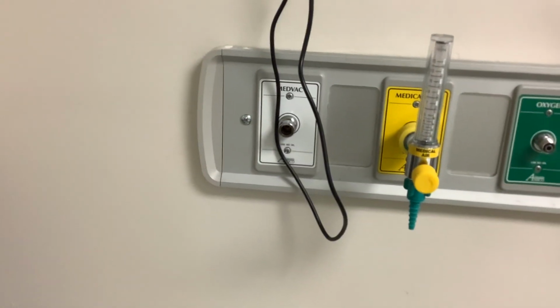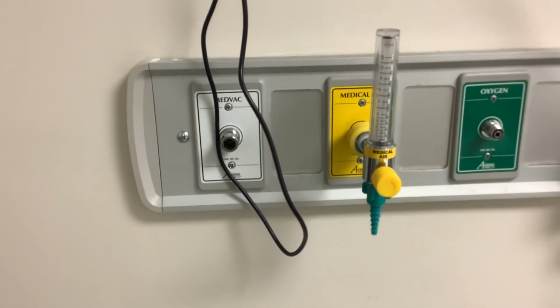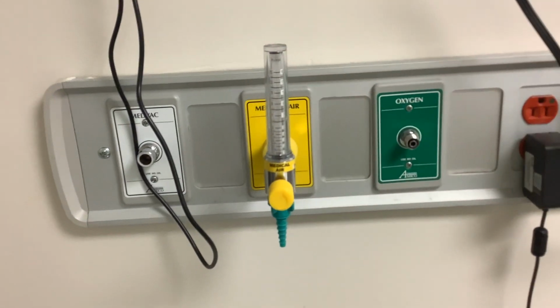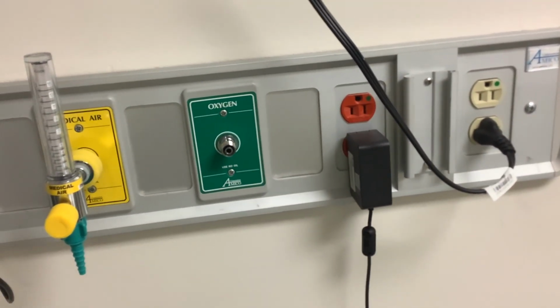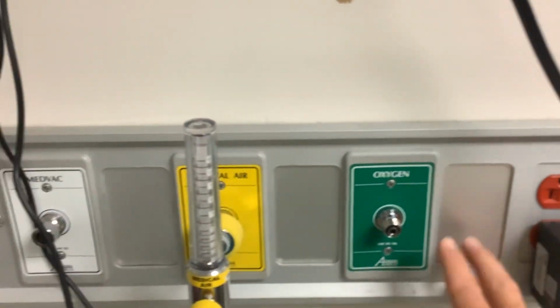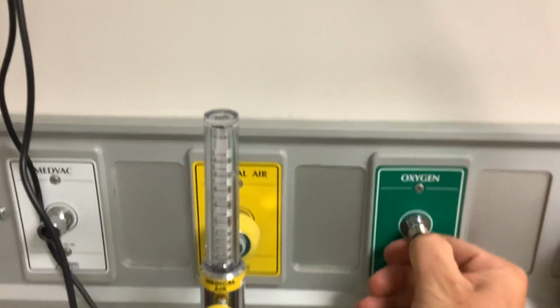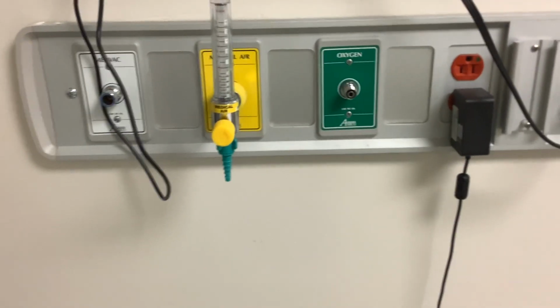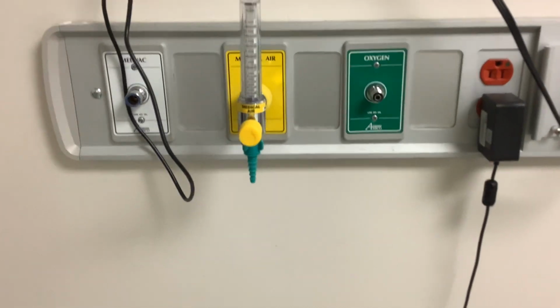So you've got medical vacuum. You can notice that medical vacuum and medical air are similar in size, but they're not the same. So only a vacuum regulator is going to go to that vacuum inlet, as opposed to only an air regulator is going to go to that air outlet, and an oxygen regulator is only going to go to that oxygen outlet. There are little check valves inside of the outlet, so if you were to depress that, and if our lines are charged, you'll hear the oxygen gas leak from the wall. Our working pressure is 50 psi. So the working pressure for respiratory therapy equipment is 50 psi.